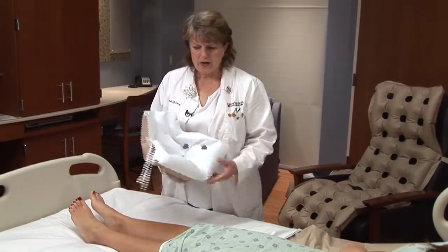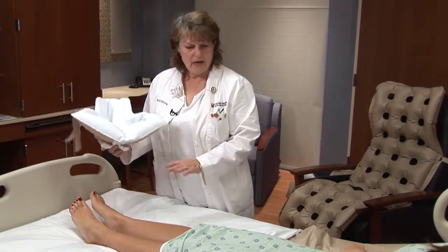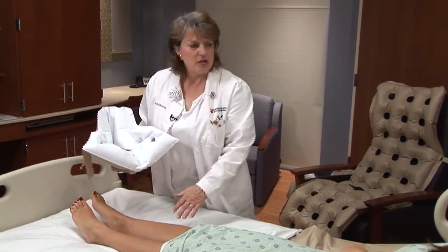Another product that we can use is called a heel elevator. The heel elevator comes in one size and it fits most people, so I do not have to measure your calf for it.